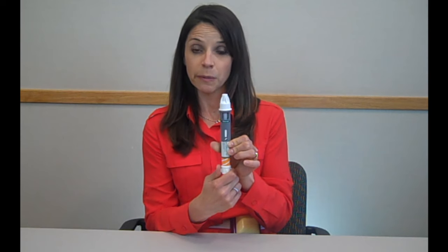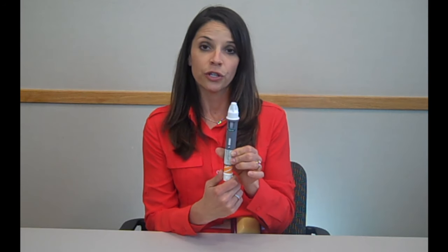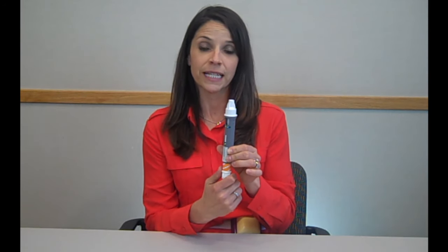Now you know your pen is ready to be mixed. To mix the pen, you're going to tap firmly against your hand 80 times, rotating every 10 times. Once you've done this 80 times, you can look into the mixing well to make sure that the medication is uniformly mixed. It should be cloudy but not clumpy. If you see any clumps, continue to firmly tap against your hand until it's uniformly mixed.